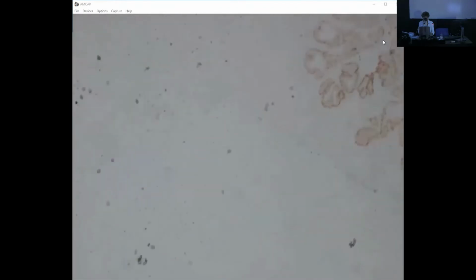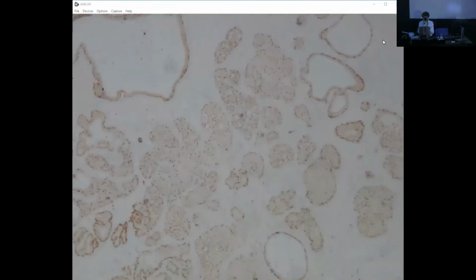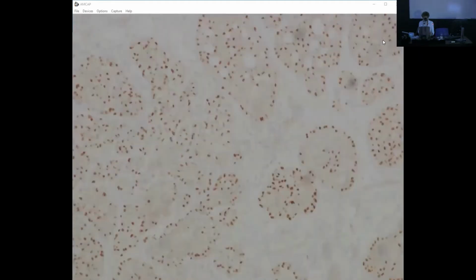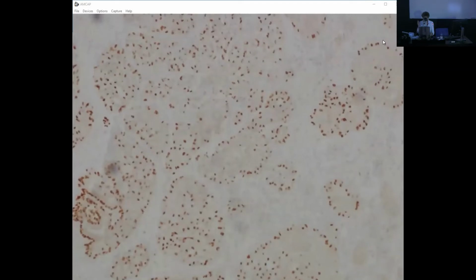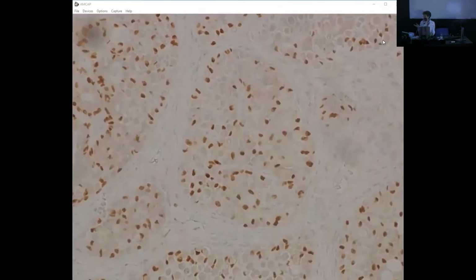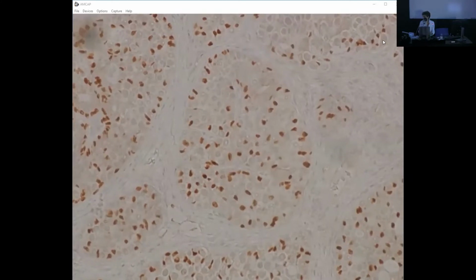Then, yeah, this is the area. This actually has the advantage compared to the ADH5 stain, the triple stain I showed you before. It really nicely highlights how the orientation of the myoepithelial cells changes in combination with lobular neoplasia. The nuclei of the myoepithelial cells are oriented vertically, and the cells grow inside together with the lobular neoplasia. It's pretty neat.